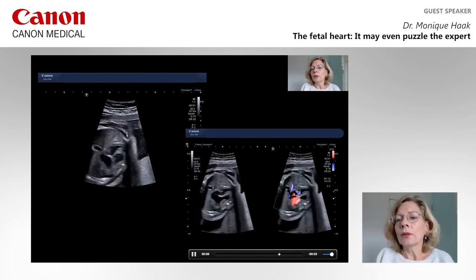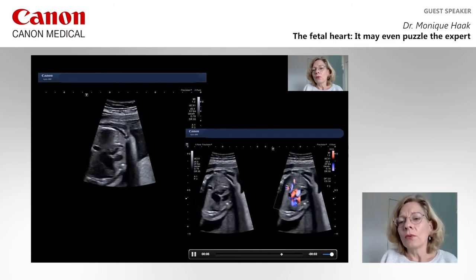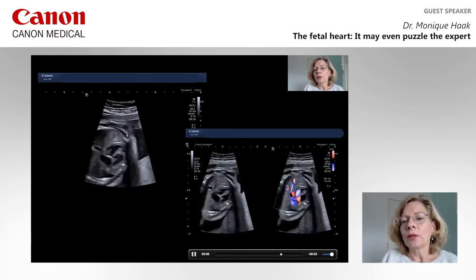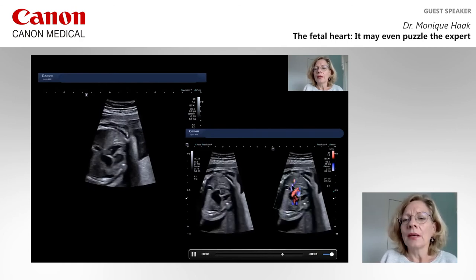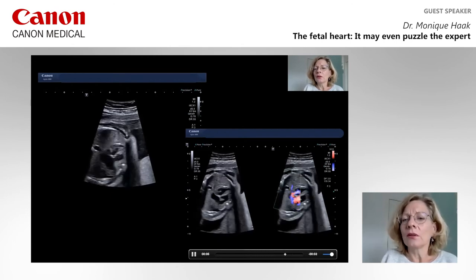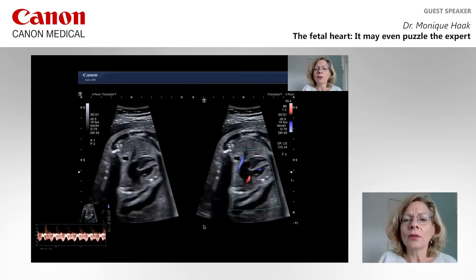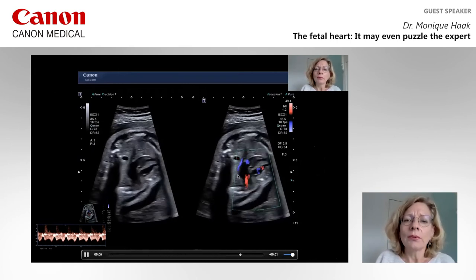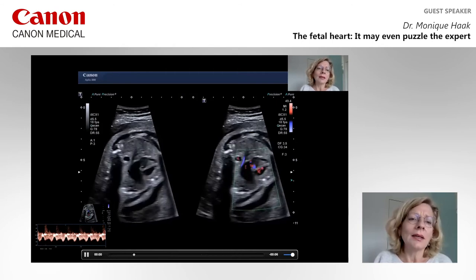If you put on your color Doppler — and please be aware the PRF should be turned low to detect low flow velocities — we see a blue signal here that resembles the entering of the pulmonary veins in the left atrium. But please, in this dual image, compare the color signal with the B-mode image. I am not convinced that blue signal is really entering that left atrium. With a little tilting and rotating of the probe, we become more convinced about our diagnosis: that blue signal is not entering the left atrium but passing by it.